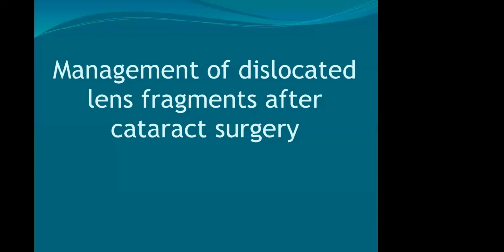There are some technical errors there. Anyway, the main thing that you have to learn is, if the vitreous face is intact, slowly reduce the bottle height to the lowest level and continue your phaco. Use enough viscoelastics to prevent the vitreous collapse.